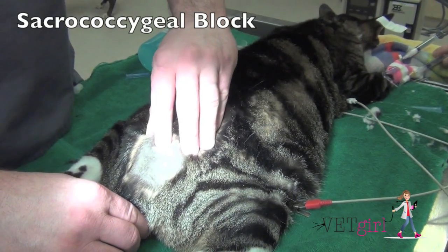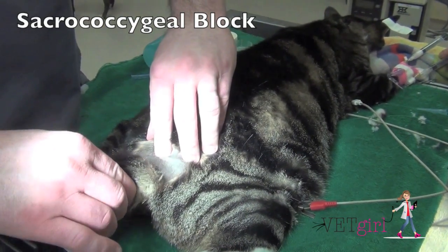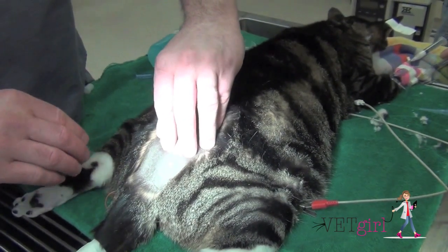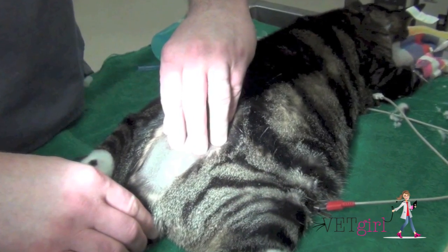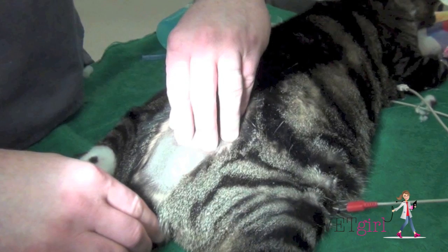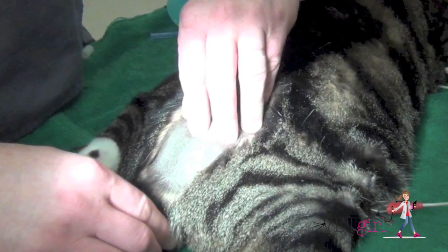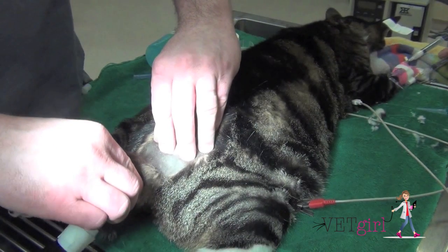In today's VetGirl video, we're going to demonstrate how to do a coccygeal epidural, which is perfect for a cat with a feline urethral obstruction. We want to use sterile technique the whole time, and what we're going to demonstrate is putting a finger in the sacrum so you know that you're going into the junction between the sacrum and the coccygeal vertebrae.